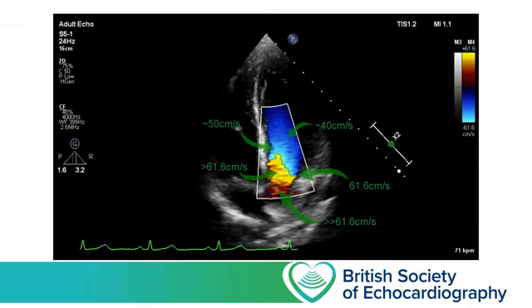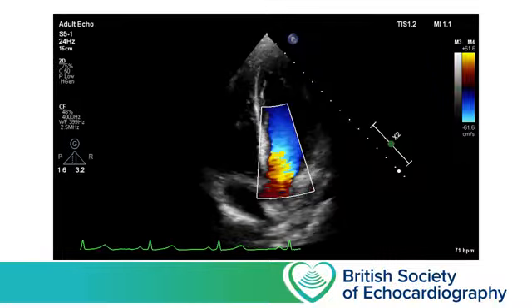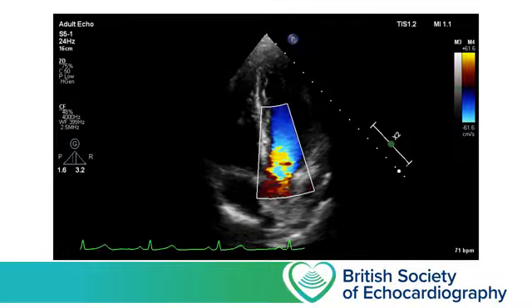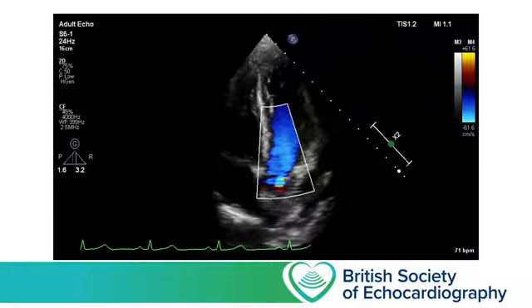And what's happened is the blood has now accelerated beyond 61.6 centimeters per second, and it's now travelling too quickly to be correctly identified. The software inaccurately imagines that it's seeing blood travelling in the opposite direction, which obviously can't be the case. This is a perfectly normal finding when visualising blood leaving the left ventricle, as blood travelling through the left ventricular outflow tract usually travels at a velocity somewhere in the order of 1 meter per second.